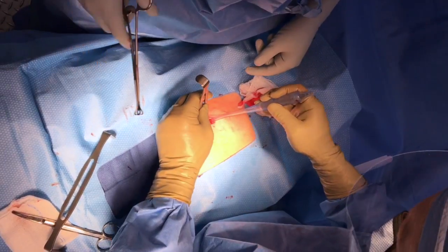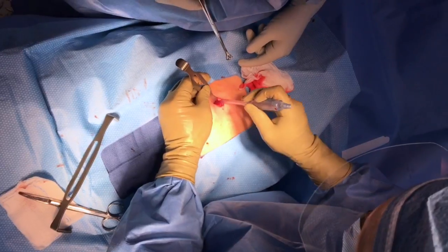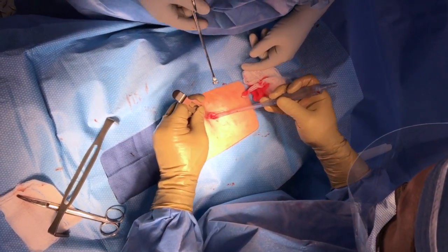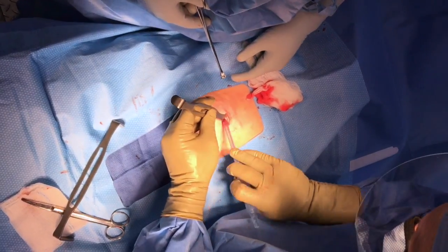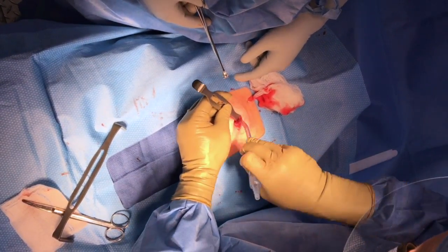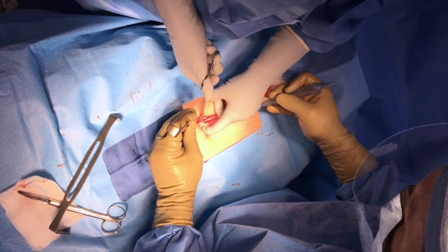Now pass the suction tip onto the fundus of the uterus, slide behind the uterus, over to the side, and pull up and out so that the tube will be reachable. You might have to do this a couple of times to get it right. Having the patient in Trendelenburg and airplane position will help.